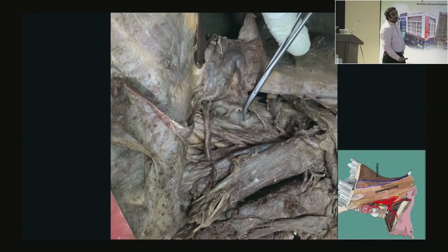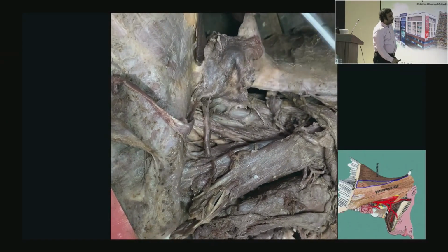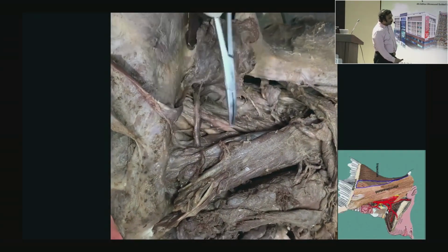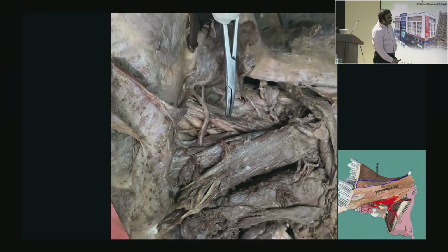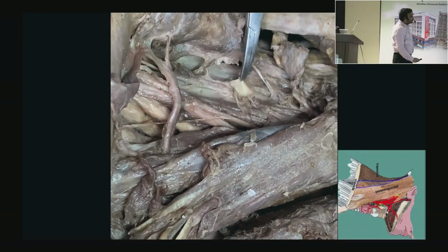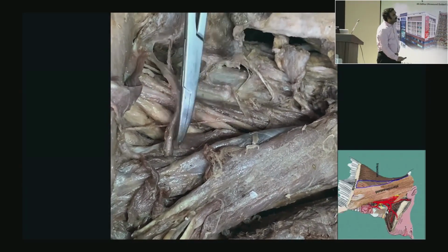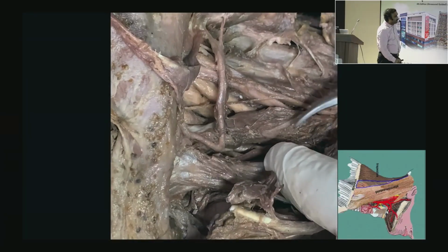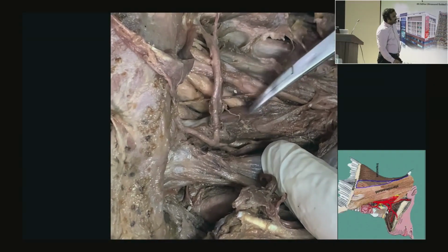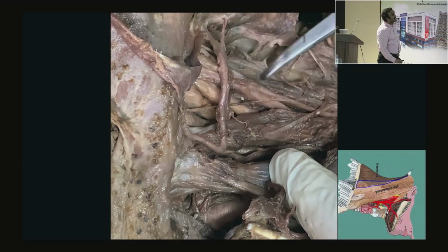So this is very important. The drug deposition has to be under the prevertebral fascia. This will be covering this posterior triangle. So it is reflected to see the brachial plexus components. So this is the prevertebral fascia, what he is holding. Now we can see nicely the anterior scalene muscle and the middle scalene muscle.